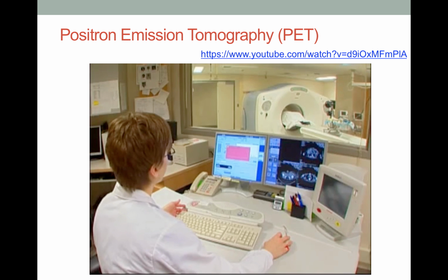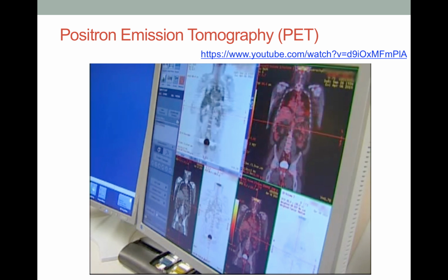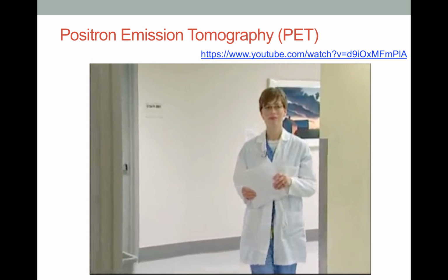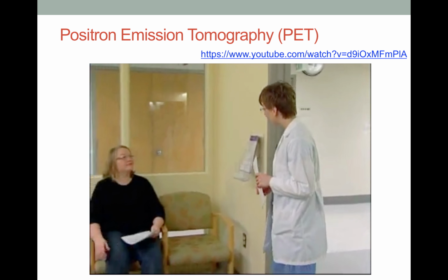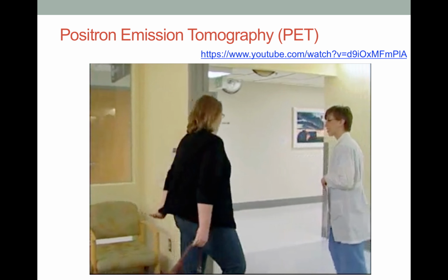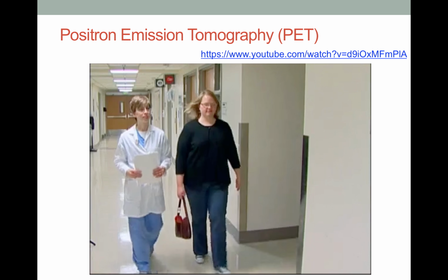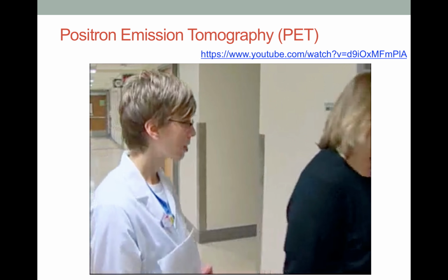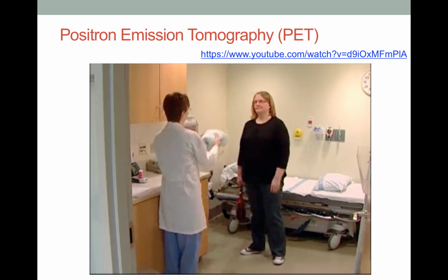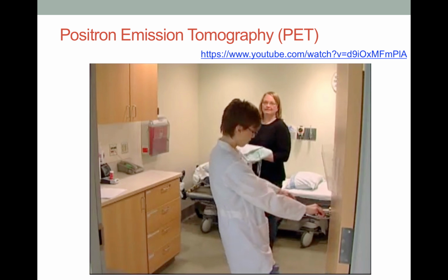PET, or positron emission tomography, captures images of minuscule changes in the body's metabolism caused by the growth of abnormal cells. Arrive 15 minutes prior to your exam. Hi, Mrs. Craven. Patients undergoing a PET scan will have restrictions on what they can eat or drink before the procedure. Contact the staff for detailed information on diet, especially if you have diabetes. The technologist will ask you to change into a gown or hospital scrubs. Do not bring children or pregnant women with you due to the radioactive material that will be injected.